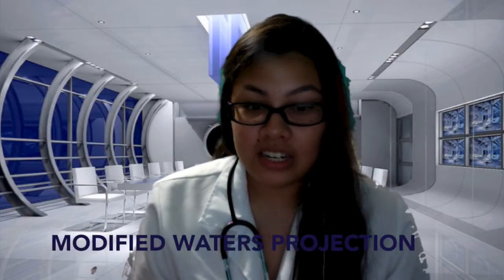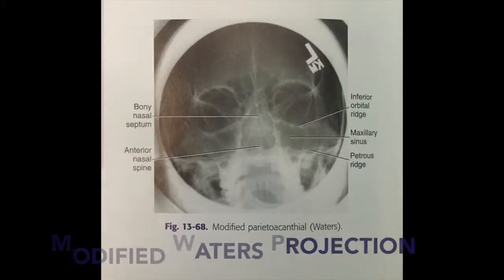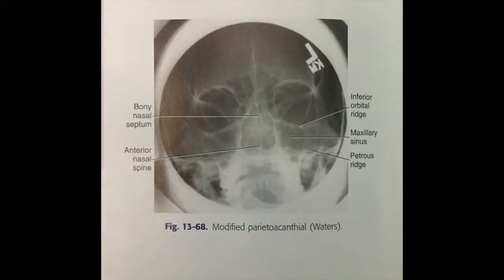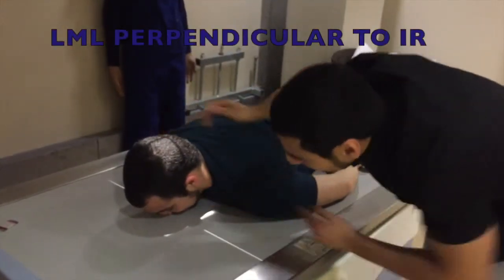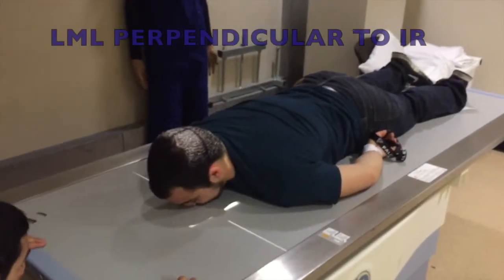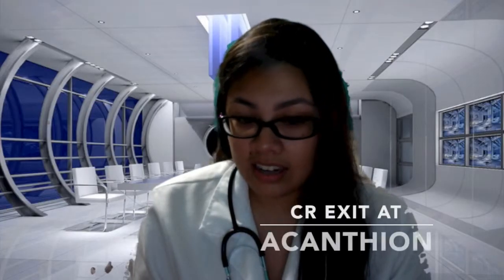In this projection, orbital fractures and neoplastic inflammatory processes are shown, and foreign bodies in the eye may also be demonstrated. Using the same technical factors, this time we adjust the head until the lips meatal line, LML, is perpendicular with the IR. This will cause the OML to be a 55-degree angle with the IR. CR will exit at the acanthion again, and don't forget to suspend inspiration.